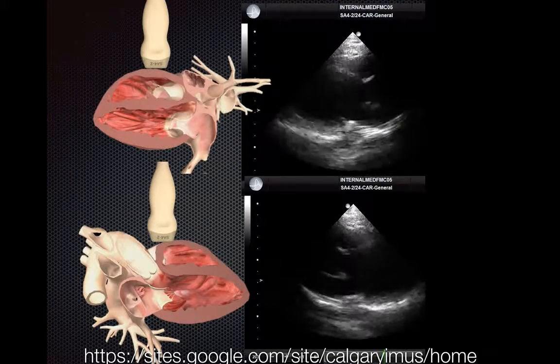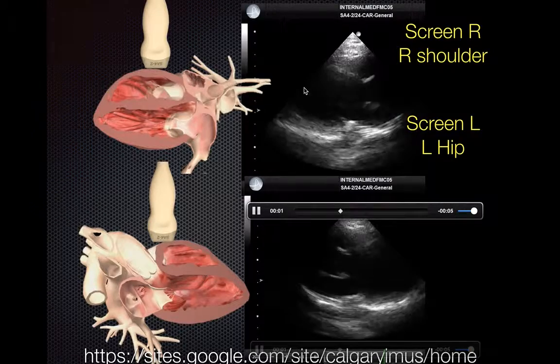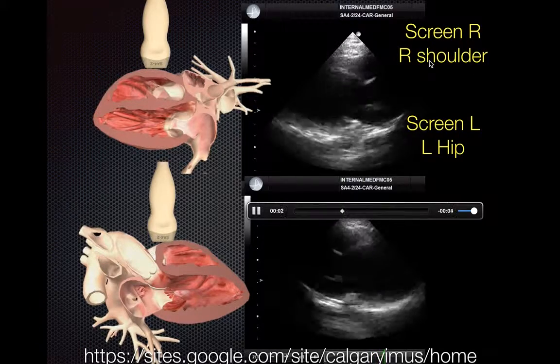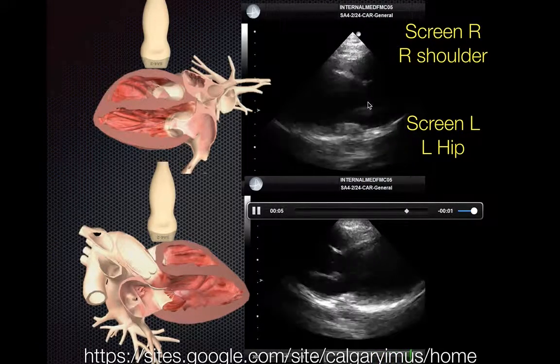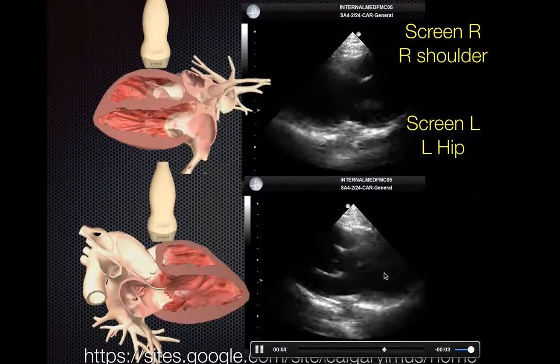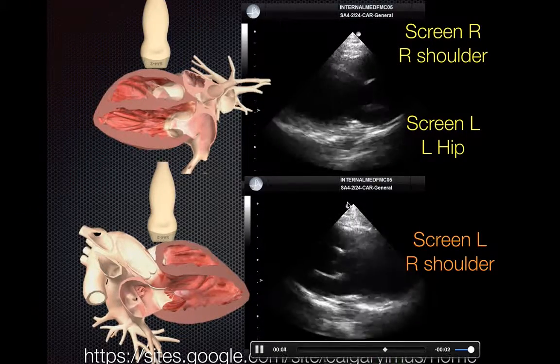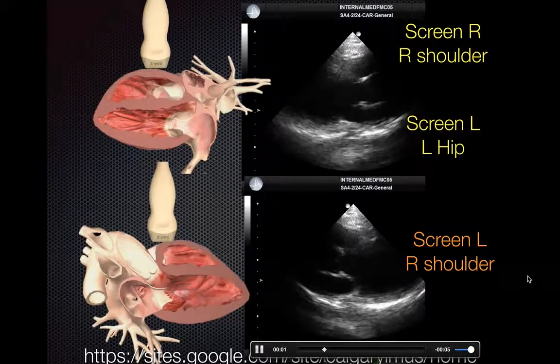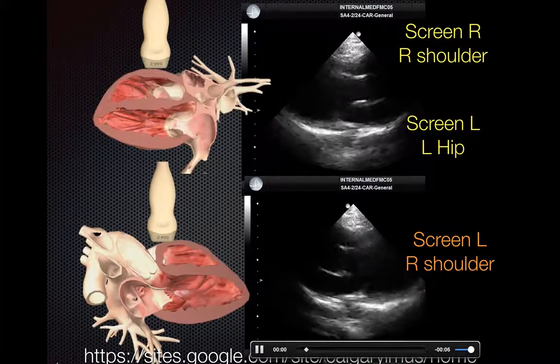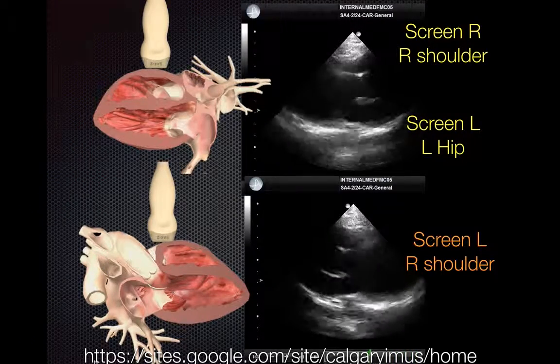The take-home message: if you want an image with the apex pointing to the left, and your screen marker is on the right, point the transducer marker to the patient's right shoulder; if the screen marker is on the left, point to the patient's left hip. If you want an image with the apex pointing to the right, your screen marker is typically on the left and you point the transducer marker to the patient's right shoulder. Thanks for tuning in — check out our website for more tutorials.